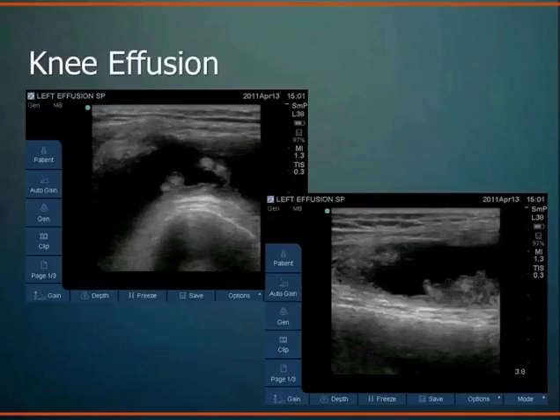those areas. This is an example, a patient I saw a couple weeks ago, joint effusion, just kind of classic presentation of knee arthritis, acute exacerbation, lots of pain, lots of swelling in the knee. This is that suprapatellar pouch of the joint space. So the knee joint space extends pretty far above the knee in that suprapatellar pouch. And when you have a joint effusion, that area can be extended or distended. And this is the fluid collection in there. So all fluid with some joint debris floating around. This is just a chronic kind of classic osteoarthritis presentation, seen quite well.